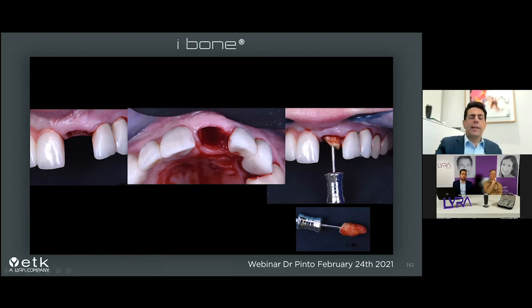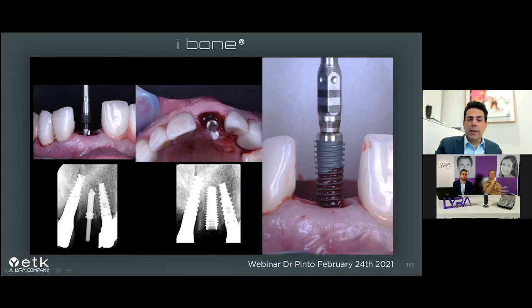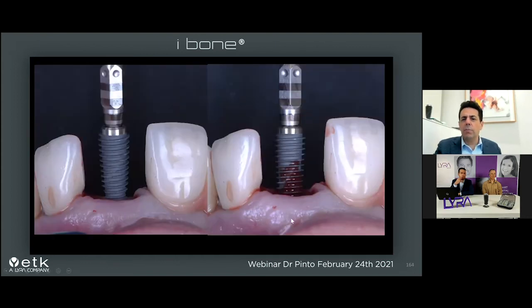So we remove the root, and we use the pilot drill to go and to check, because we wanted to be sure that we are in the good direction. We didn't have time to make a surgical guide, so we preferred to take some X-rays to be sure. And like you see, when you put the implant, you see how the blood goes very quickly onto the implant. It's very magic to actually see this kind of nature going on around the implant, and they accept the implant when the implant goes in. And you see, when you present the implant, you have blood immediately going and trying to cover the implant.